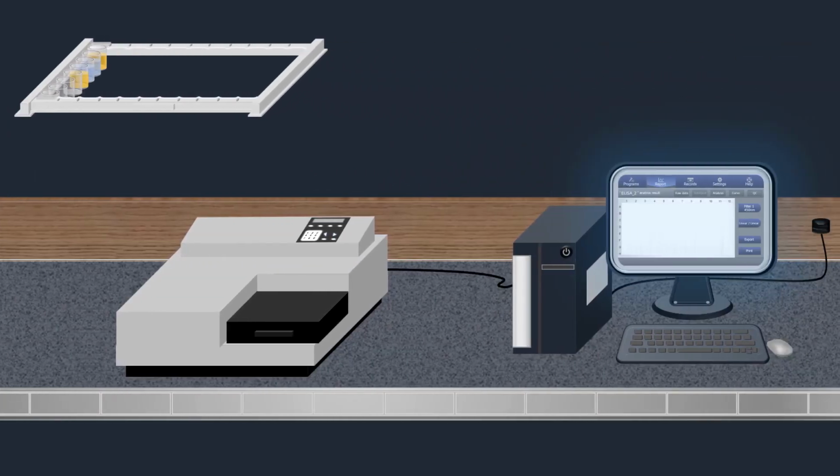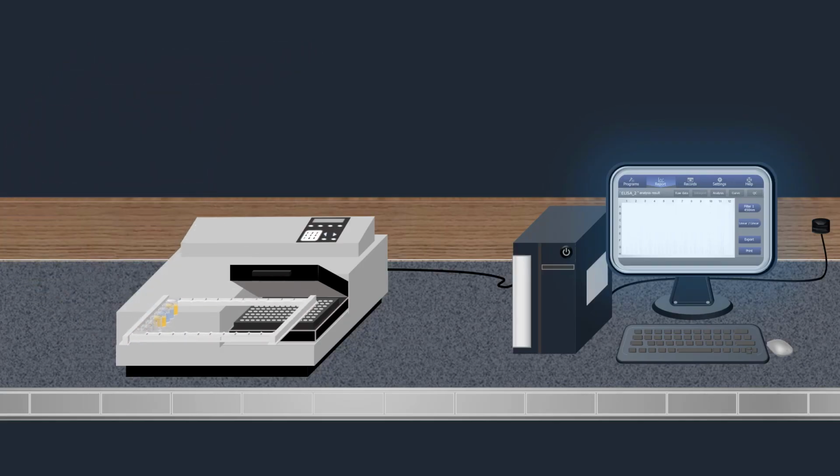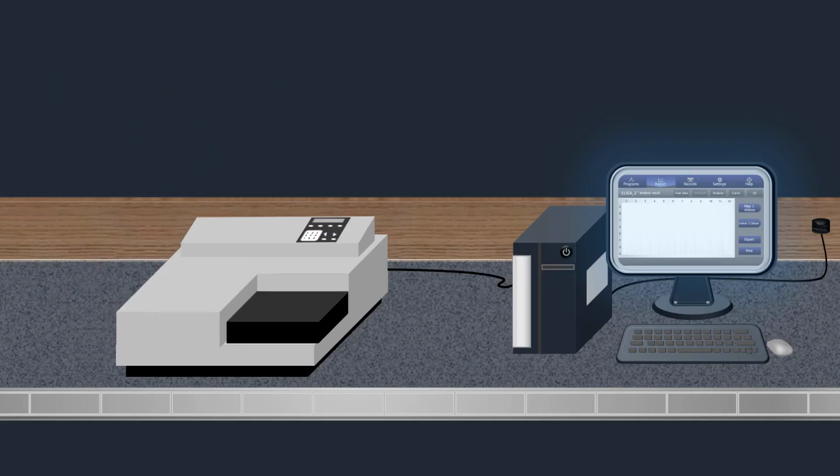Next, for confirmation and interpretation of the obtained results, the spectrometer instrument is used to read the absorbance in each well and to confirm whether the patient is carrying the HIV virus or not.